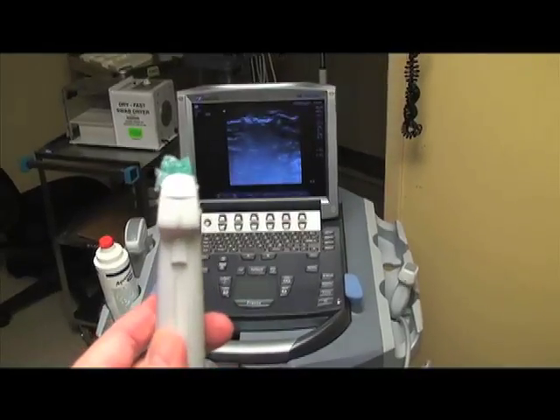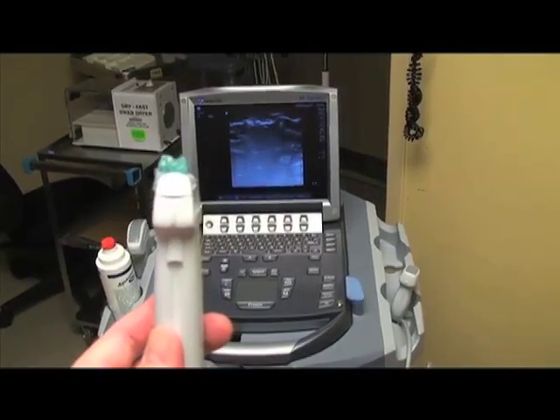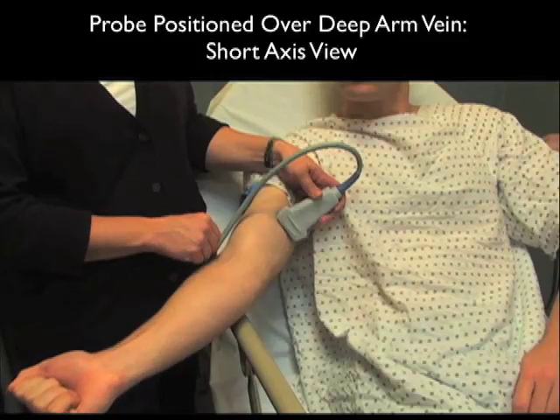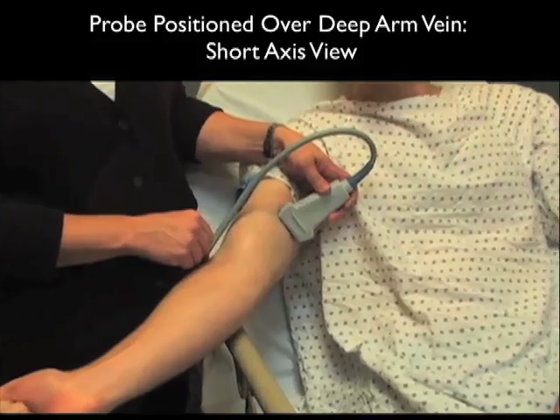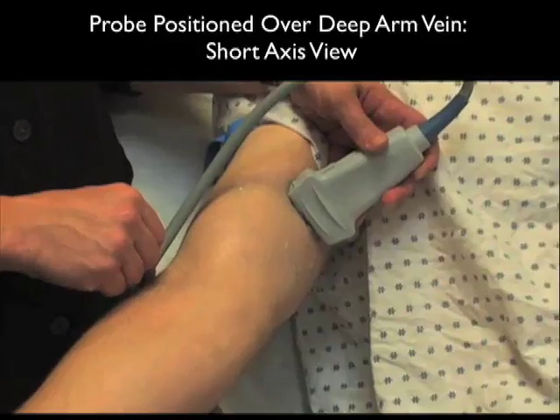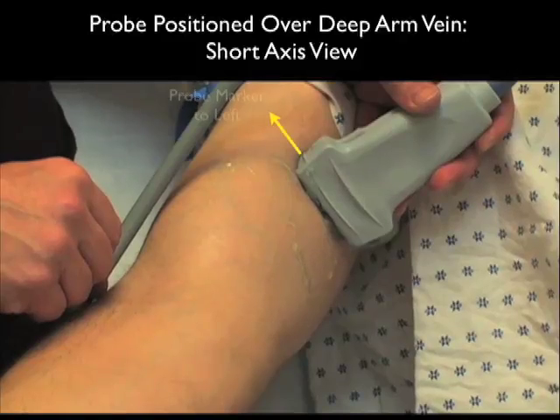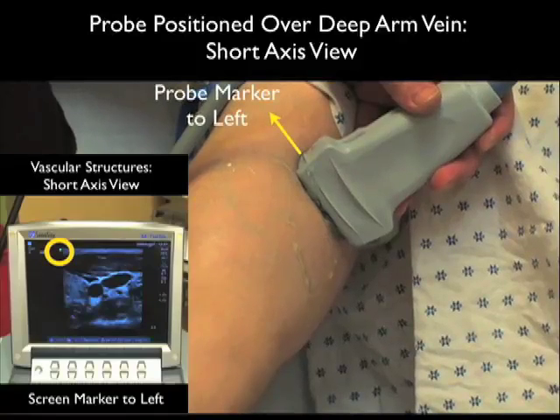Here's the high frequency linear array probe that we'll be using for vascular access, and that line on the side is the indicator marker on the probe. Here it's placed on the patient's upper arm in a short axis or side-to-side configuration, positioned over the more medial basilic vein. Notice that the probe marker here is towards our left as we stand in front of the patient, and on the screen the indicator dot is also located to the left — therefore left on the probe lines up with left on the screen.